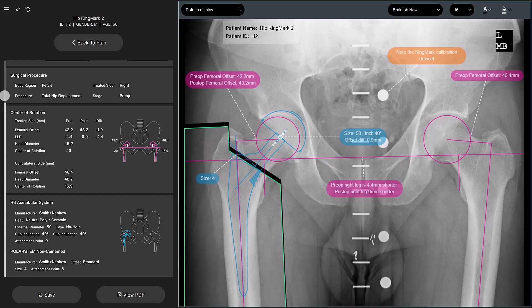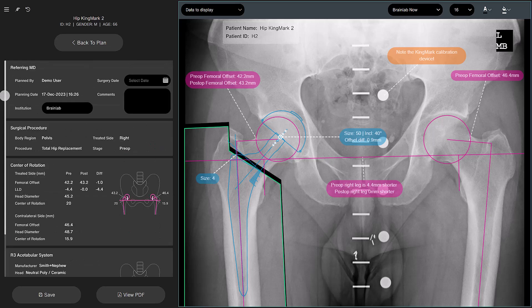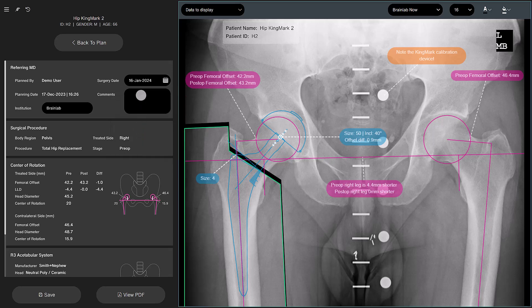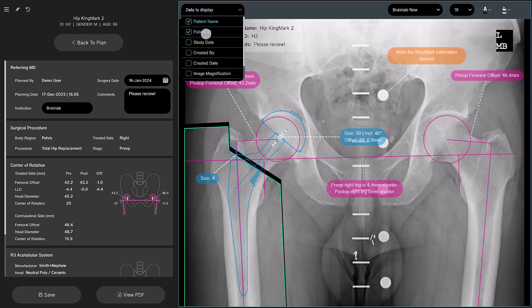To complete TraumaCAD NEO surgery planning, select the surgery date from the calendar, then add a comment to the report if you want somebody else to review this plan. You have the option of going to the Data to Display drop-down menu and only selecting the data you wish to have displayed in the report.